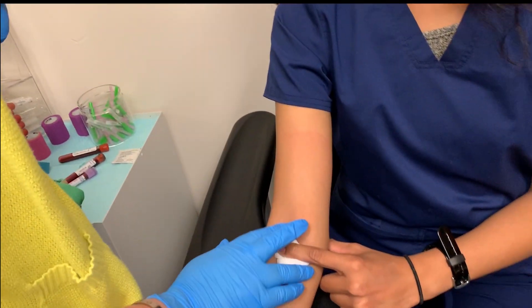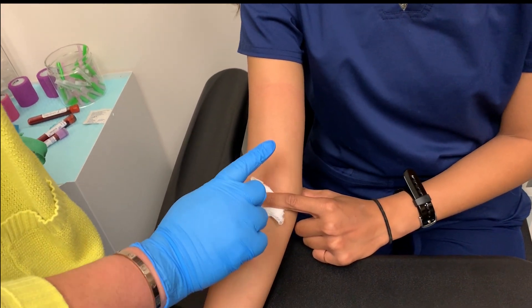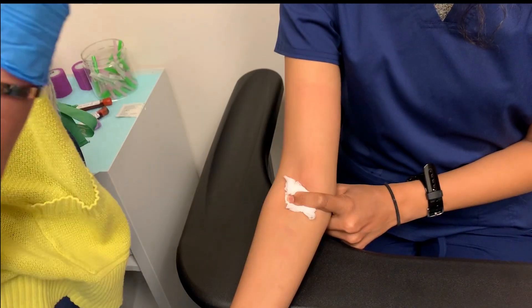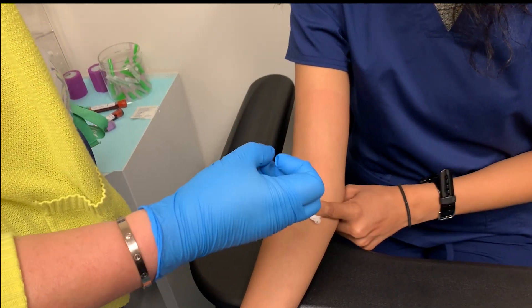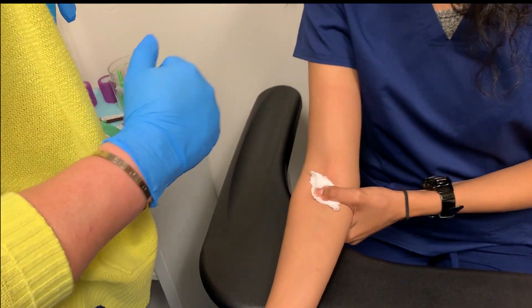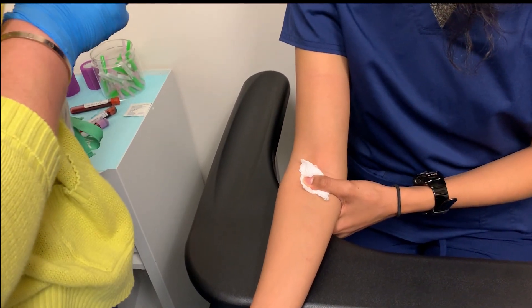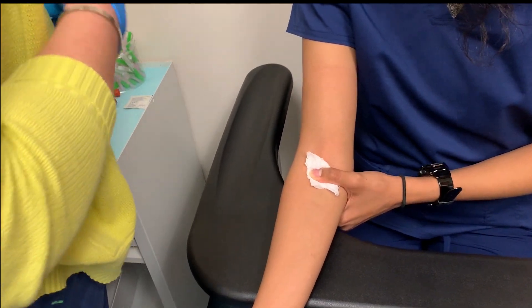The last thing you want to make sure is that you have the patient hold pressure down over their puncture wound for a little while to help prevent a bruise from forming. A lot of times patients are told to bend their arm, but that doesn't really do a whole lot to prevent bruising. Holding pressure down will stop the bleeding, activate the clot process, and help prevent bruising more than bending or holding their arm up will.